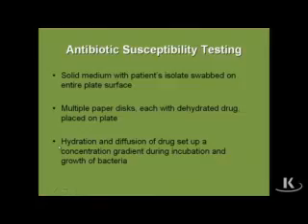So what you're going to do with susceptibility testing is you're going to clearly have to isolate the organism from the patient, and once you get it isolated, you're going to culture it, swab a plate that is coated with the isolate, and there are, from that point, numerous ways that you can test whether or not that particular strain of bacteria is resistant to certain drugs.